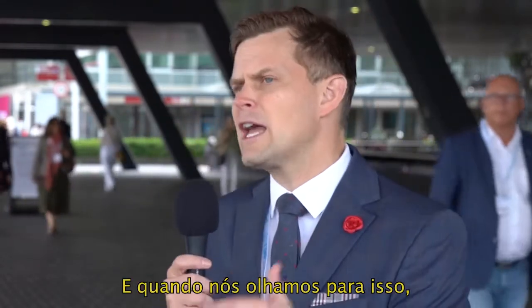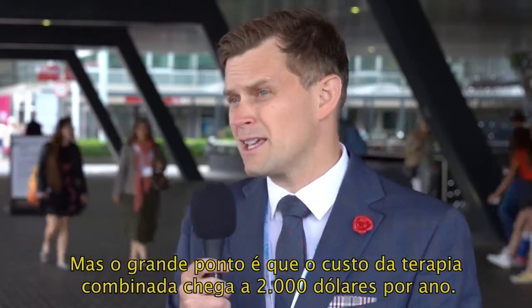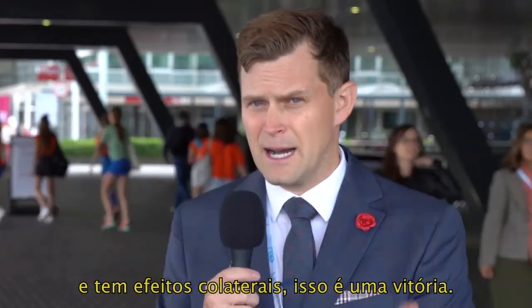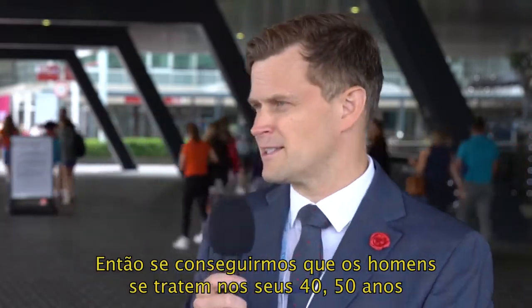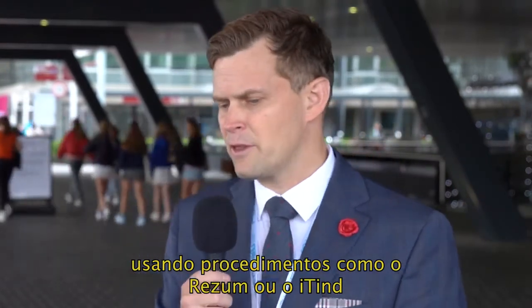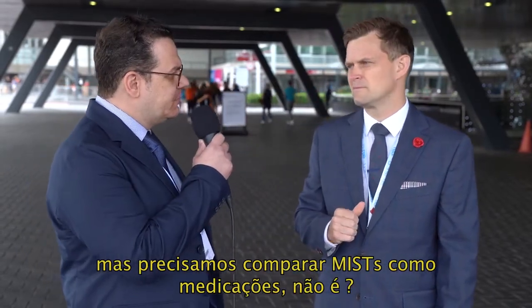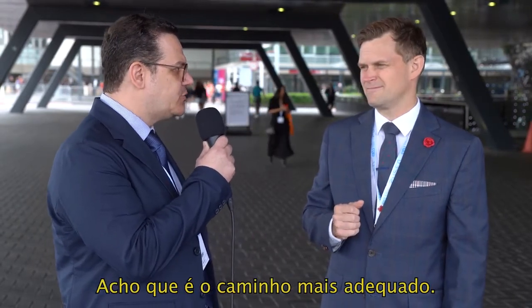And the way I like to look at this is that we're always comparing surgeries beating other surgeries. But the big thing is the cost of dual therapy is about $1,000-$2,000 a year. And to get someone off drug therapy, which doesn't always work and comes with other side effects, that's a win. So if we can get men early in their 40s and 50s and not have to take 20 years of drug therapy, and getting them off with either iTind or Rezum, I think that's the way to go. We are tending to compare MIST with surgery, but we need to compare MIST with medication, isn't it? I think that's a better way to go.